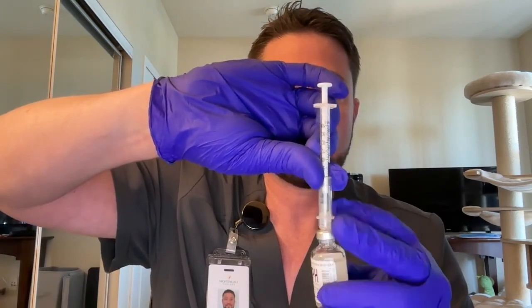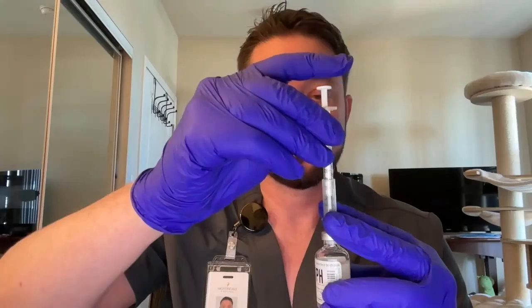Without touching the needle, we're going to insert the needle directly into the vial of NPH. Without touching the medication, we want to expel the air in our syringe into the vial, and we want to remove the needle from the vial and set it aside. We're then going to go back into our MAR.